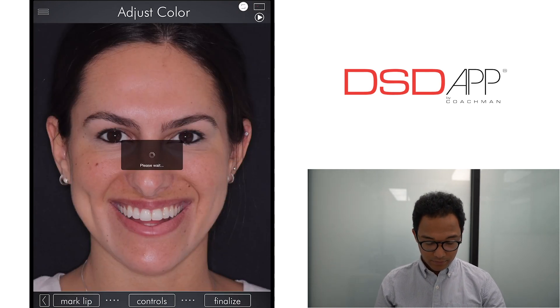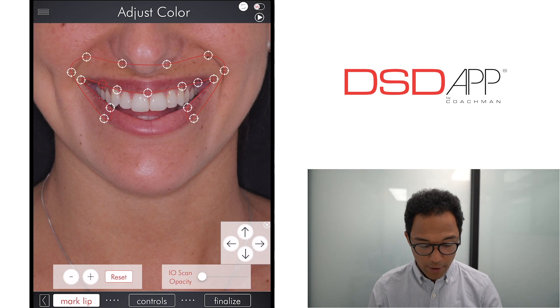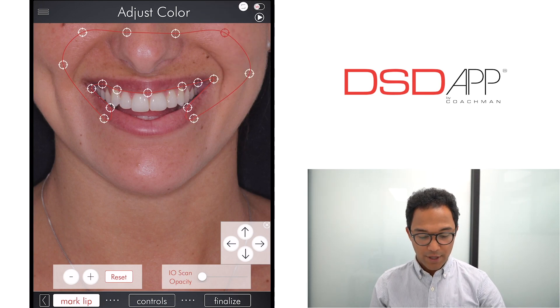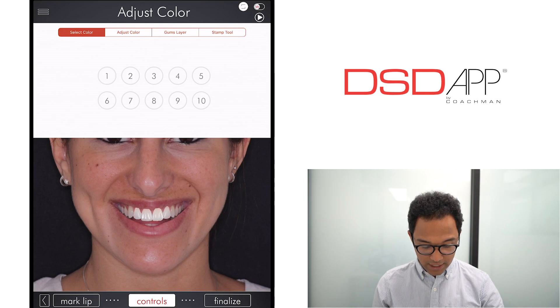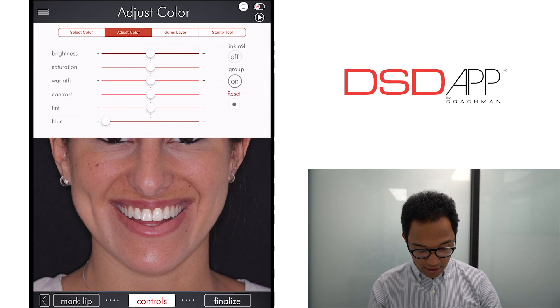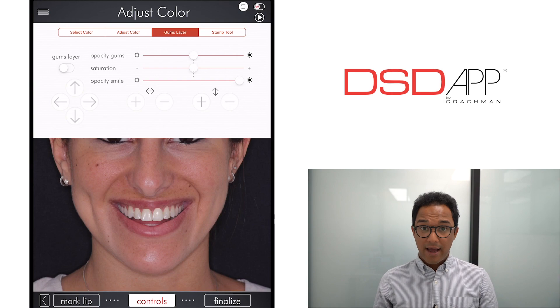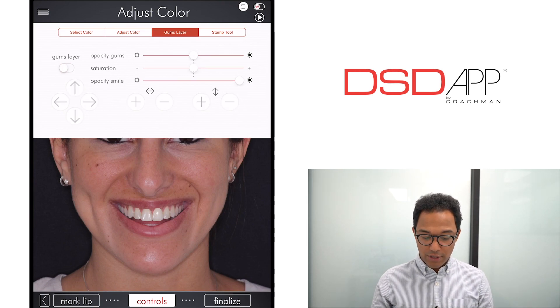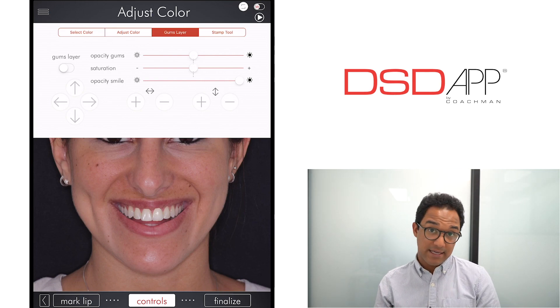On the next step, we will mark the lip, which is something like Photoshop. What you want to do here is make sure that the STL and the lips are within the area we are covering. Let's select a good color for the smile design. You can adjust the colors if needed. You can also add gum layers — for example, if the patient wants to do a peri-procedure and you want to show that to them. In this case, we are not going to do that because we are not doing any gingivectomy or aesthetic gum procedures.